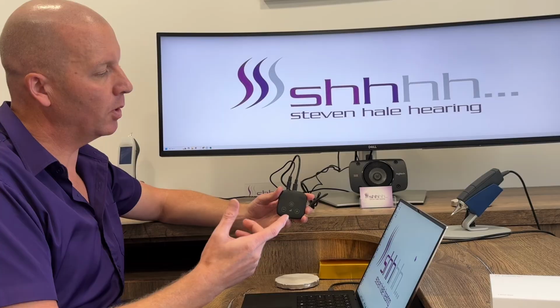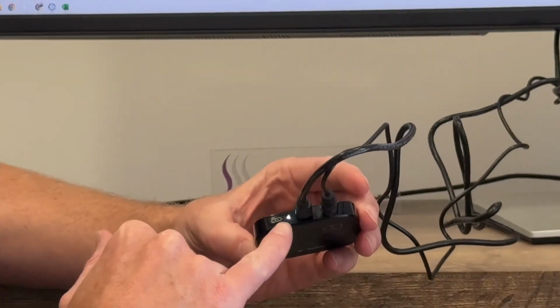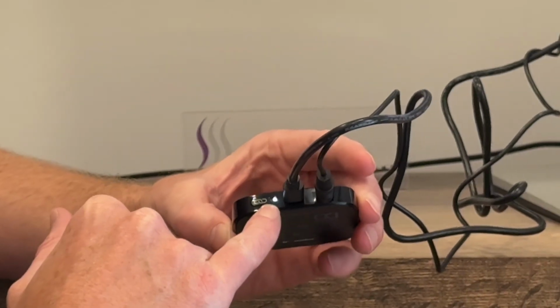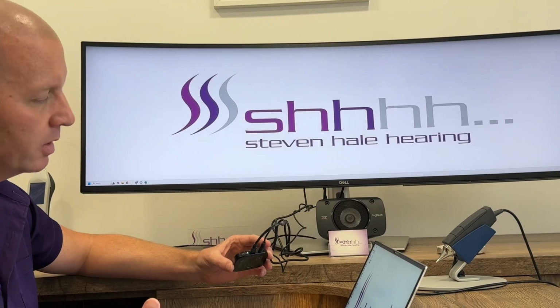We're all plugged in now, TV connector's in. We want to confirm that there's power first of all, and you can see if we look on the reverse, there's a light on to show that we have got power. You've got to have your TV turned on because that's what's providing the power into the unit.